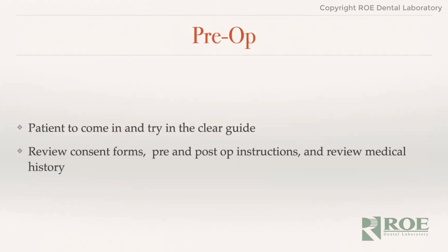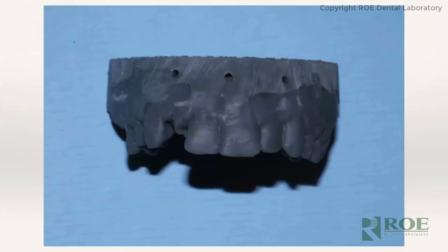In my opinion, I don't go forth. I can't tell a patient we're going to do it free-handed after I've extolled the wonderful aspects of it being guided. And then also we have to review consent forms, go over the consults, make sure we got everything done, the pre and post-op instructions, and review the medical history one more time to make sure everybody's on board.